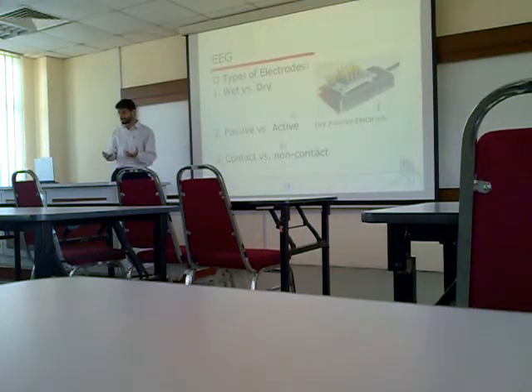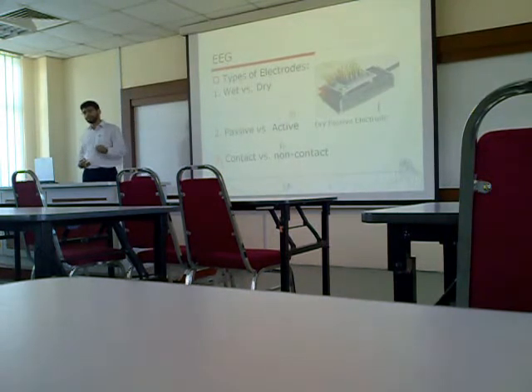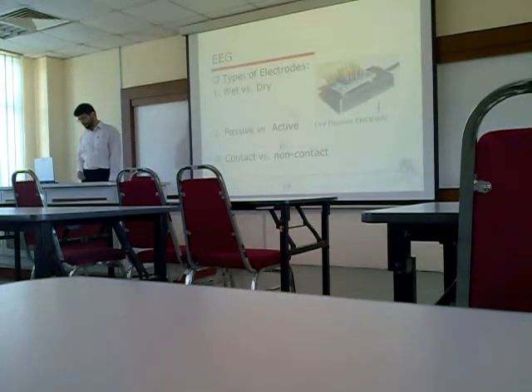So the electrode is an active type, and maybe even wirelessly transmitted. You will see that there is a small electrical part directly on the scalp, and there is wireless transmission of the signal that is picked up. It is much more useful for animals that are moving, where the wire may be a problem.